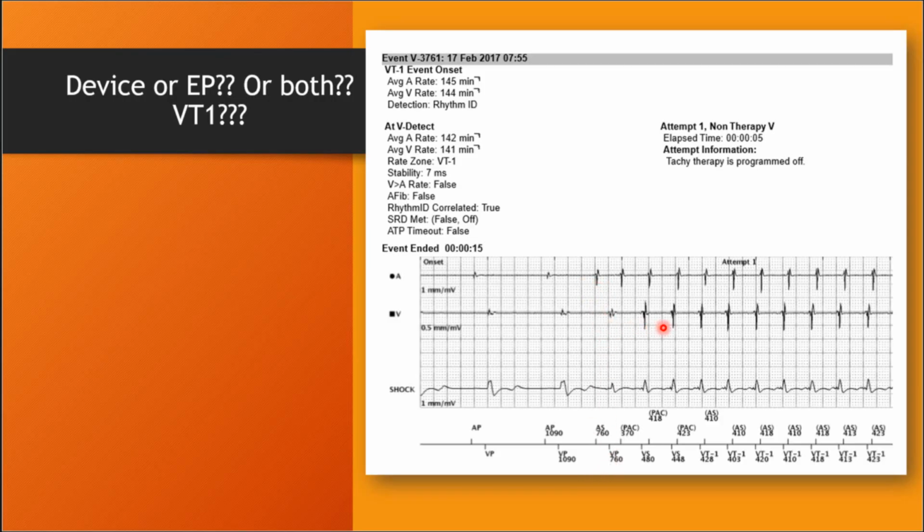And yes, it goes into a tachycardia, but do tachycardias start with atrial premature beats usually? Well, this atrial premature beat goes very slowly down the AV delay, slow enough that a ventricular paced beat comes in. But is that enough to block maybe the fast pathway? And then we see a second atrial premature beat. And that comes too early. It comes in the blanking period. It's a premature atrial complex that doesn't really want a V pace on it. And it allows it to go down, well, what we might call a slow pathway here.